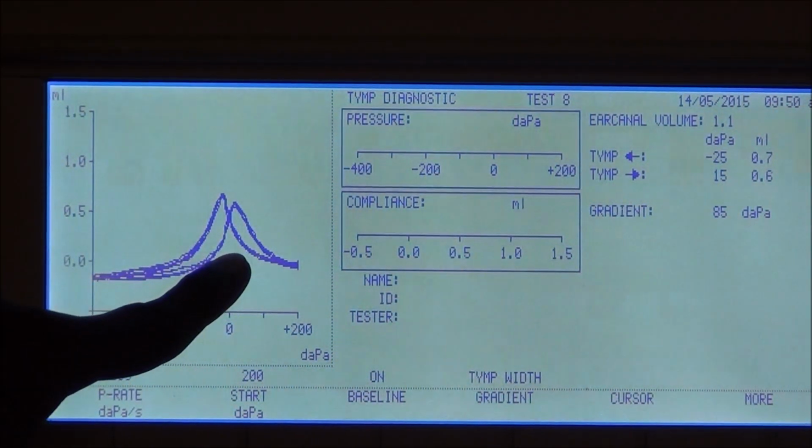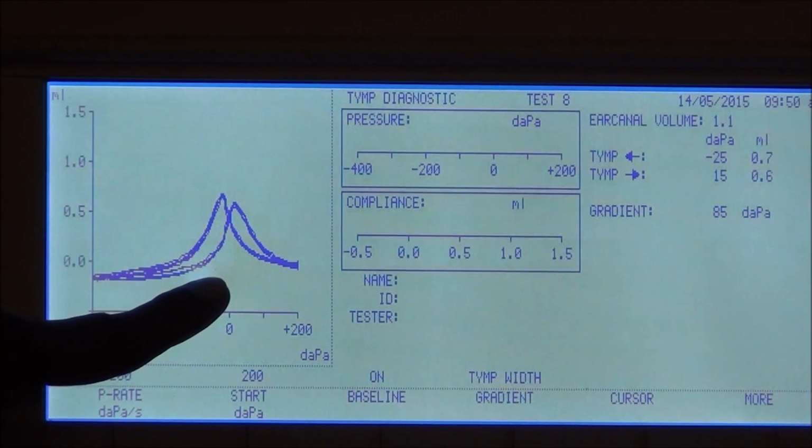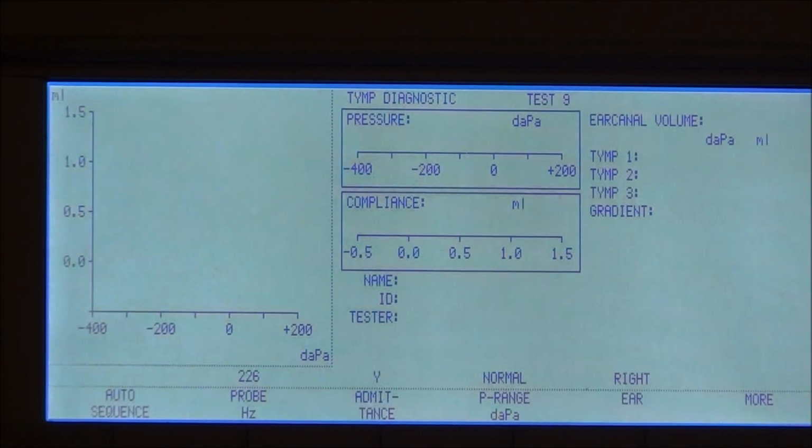Now the biggest error we make in tympanogram findings is considering the direction effect as pathology. Do you understand? Considering the direction effect as pathology. So what have we done now? Tympanogram, what is it?